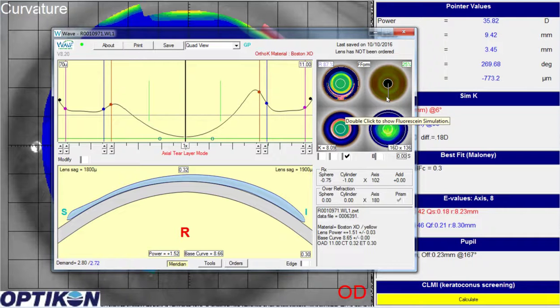And then if you have the lab dot the lens at 6 o'clock, then the patient can also perhaps see a little bit where that lens is when it's ready to come out in the morning. So it's not a guarantee the lens is going to go where we want it to go, but at least it's going to let us know where it has gone if it does move. So hopefully this will put a little bit of with the rule astigmatism into the cornea and get your patient seeing a little bit better. So those are my thoughts. Best of luck with your case.